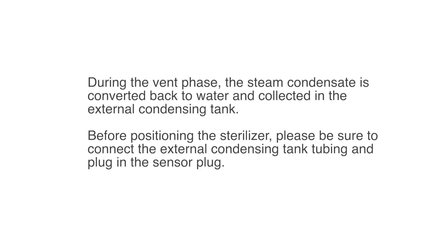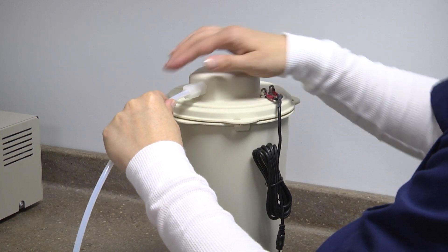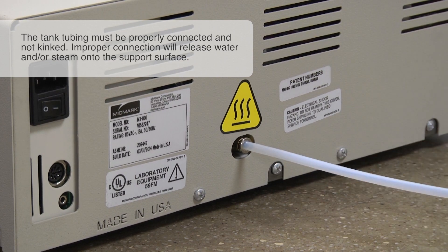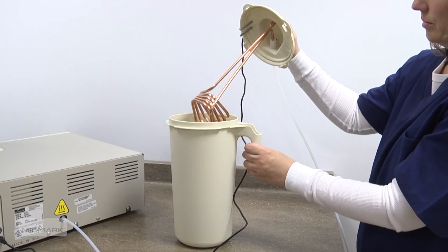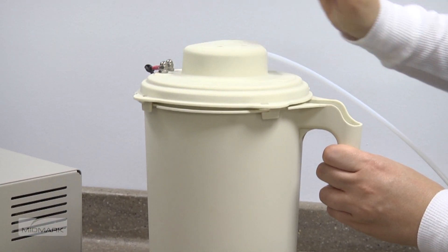The M3 Ultrafast uses an external condensing tank to collect used water. During the vent phase, the steam condensate is converted back to water and collected in the external condensing tank. Before positioning the sterilizer, please be sure to connect the external condensing tank tubing and plug in the sensor plug. To connect the condensing tank, push the tank tubing into the compression fitting on the lid and tighten the nut. Then connect the tubing to the back of the sterilizer by pressing it firmly into the push-connect fitting. Next, connect the sensor plug to the port on the back of the autoclave. Fill the tank with tap water to the minimum water level indicator line. Insert the lid assembly into the pitcher, align the tabs for correct positioning, and rotate clockwise to secure.